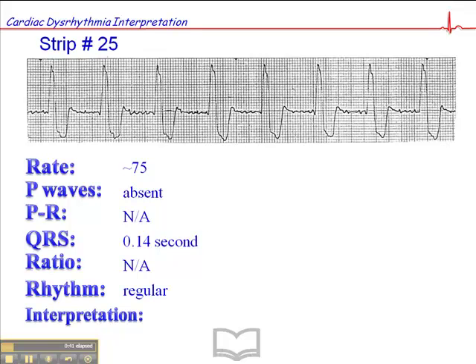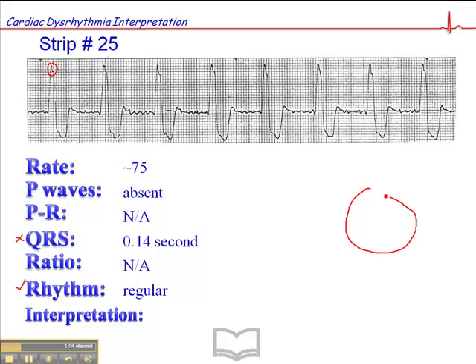The rhythm is regular. So we have a wide QRS complex with a regular rhythm, and when you see a wide QRS with a regular rhythm, we would have to assume that that is an idioventricular rhythm — a single focus coming from the ventricles that's controlling that heart rate.